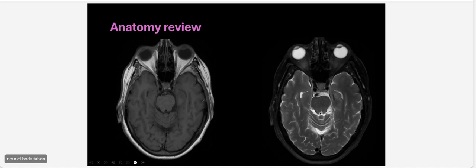If it is patent, and actually we are looking mainly in the sagittal cuts. You can still look at the axial, but the sagittal is important, so you can see if there is obstruction or narrowing. So you can think about obstructive hydrocephalus, especially in kids. And if it's communicating and nothing is obstructive, and still you suspect a hydrocephalus, so in this case, maybe something else, and it is named communicating hydrocephalus, and it has a lot of reasons.